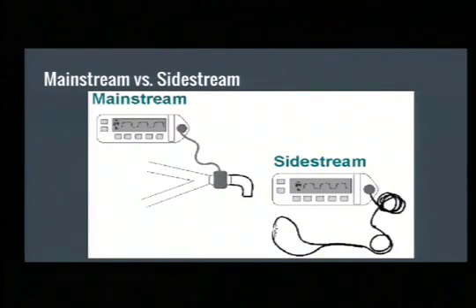And we have both mainstream, for our intubated patients, which you hook up to your ET tube and your vent, and side stream, the little walruses that we put on the patients. So in your asthmatics, your COPDers, all your non-intubated patients, you're going to be doing side stream, and this is the same thing we put on for procedural sedation in all of our ER patients.